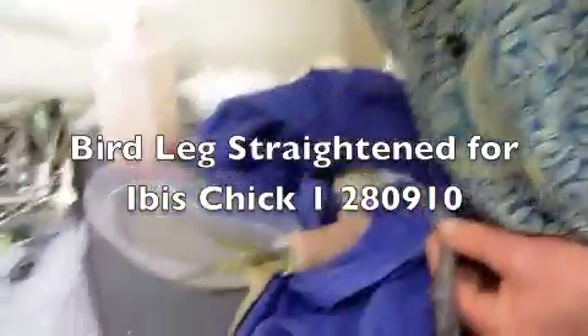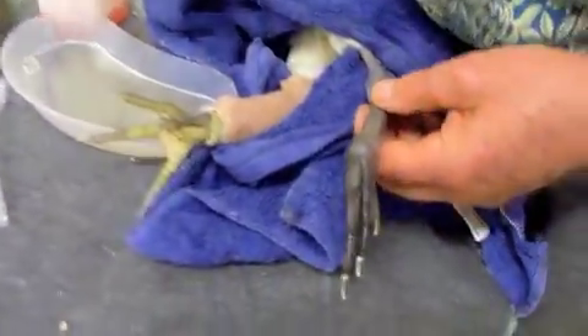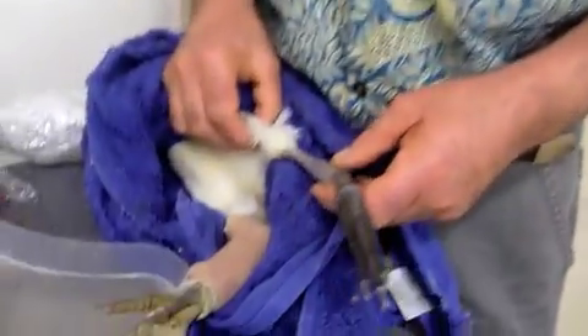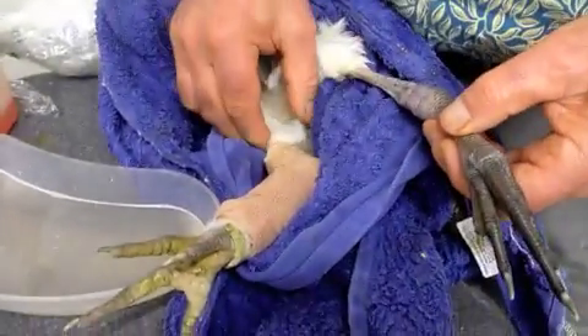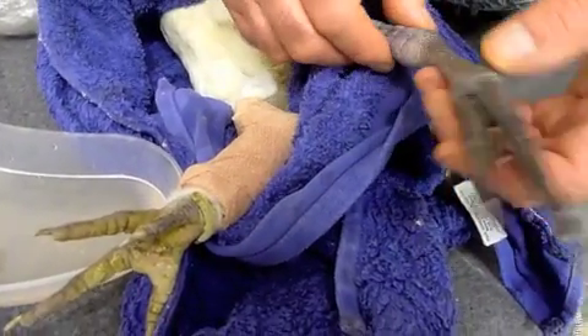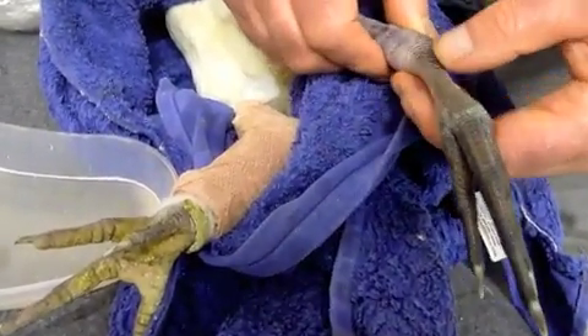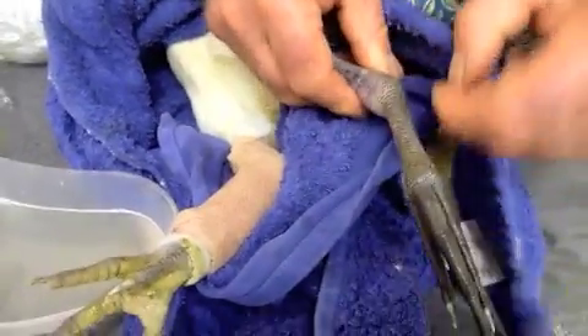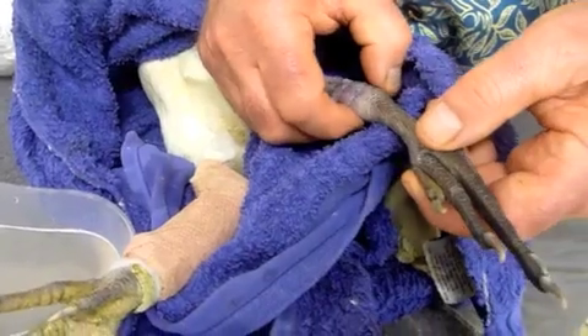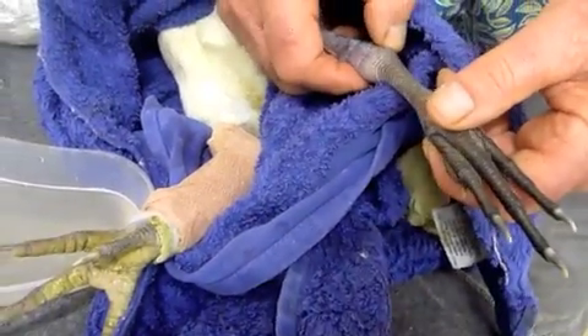This ibis chick, currently under anesthesia, has been putting all its weight on this leg. On a suspected previously unbalanced diet, things have given way here.